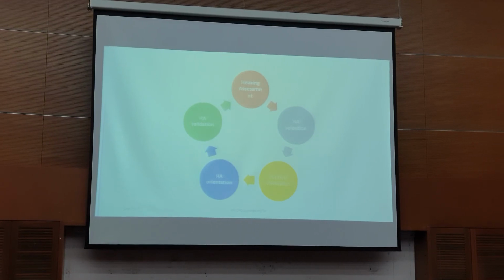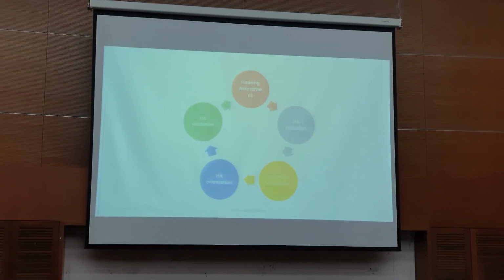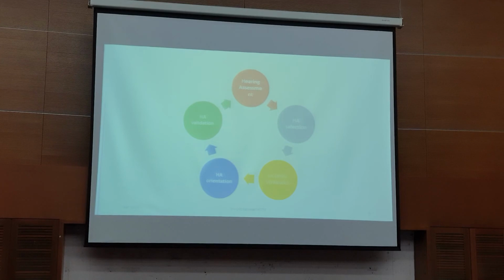You know, kalau pediatric, because dia punya canal will be very small, then you probably think you bagi macam this much amplification, tapi sebenarnya bila masuk dalam telinga dia, because there's a very small volume, then they actually amplify a lot more, and you don't want to damage the child's hearing. Alright, you talk about recruitment. Beberapa kali I dengar, yes, recruitment is also something we need to consider, and that again we need to measure at the eardrum. So we have our targets.